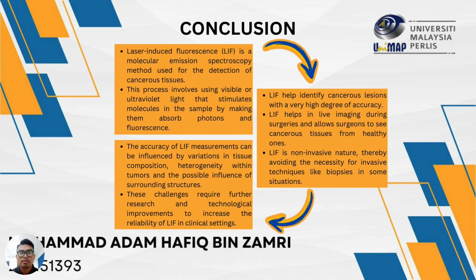There are three advantages that I can conclude. LIF helps identify cancerous lesions with a very high degree of accuracy. It also helps in live imaging during surgeries and allows surgeons to distinguish cancerous tissues from healthy ones. And lastly, it is non-invasive, which avoids the necessity of invasive techniques like biopsies in some situations.